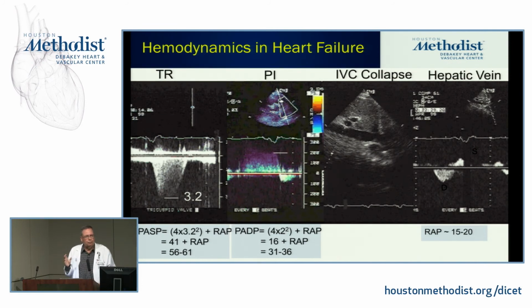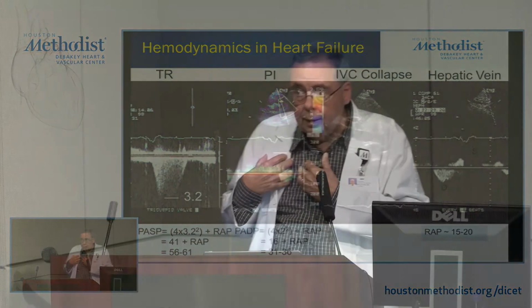But there's at least 40% of times that I don't feel comfortable saying that this is 5, 7, 12, 15. I think the range is more honest. So personally, I'm going to stick with giving a range. I'm not sure what you think, but I feel a lot more comfortable in many cases giving that range, rather than to fix myself to a number that you can't always be sure of.